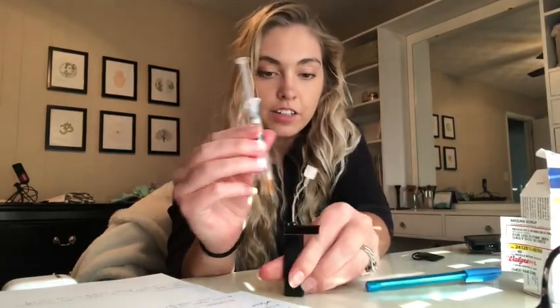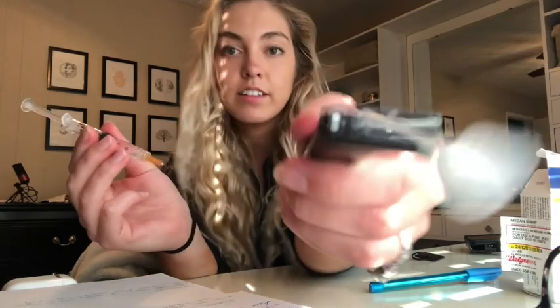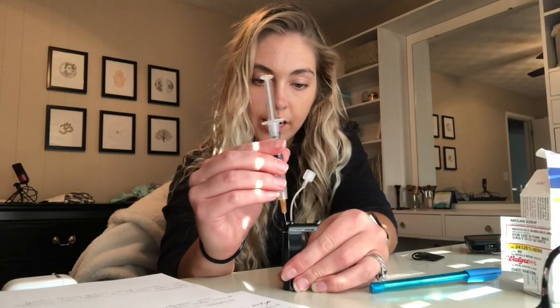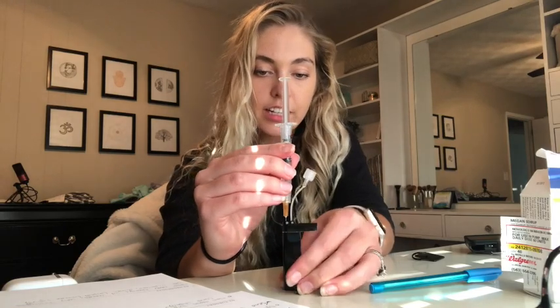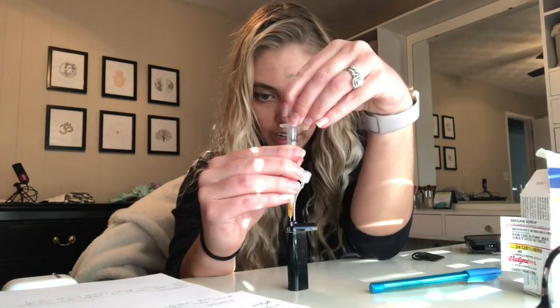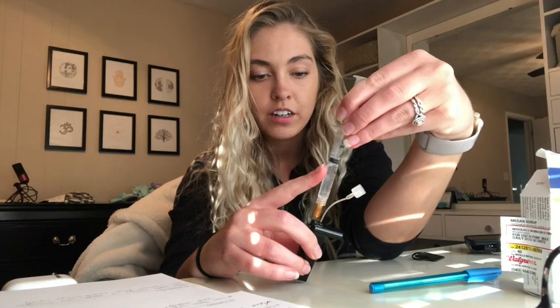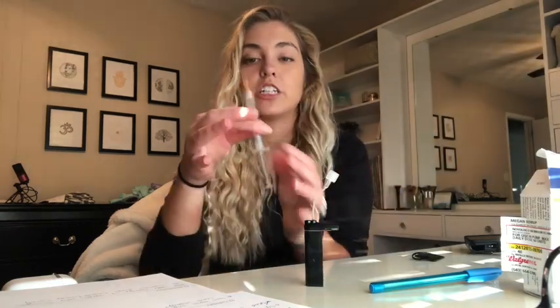So with the cartridge, this is how they look. So I just set mine down and then take my syringe and poke it in. There's like a little white dot. So I poke it into the little white dot, like halfway down. You'll feel it stop. And then I just pull up to pull out some of the air that's in the cartridge. And then when I can't pull up anymore, I slowly pull the syringe out from the cartridge.